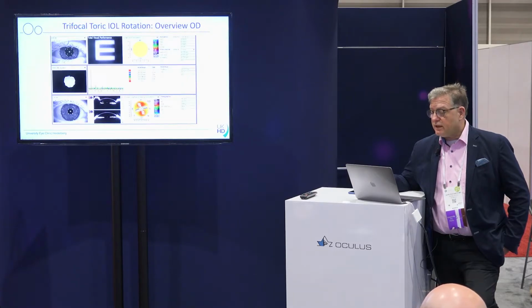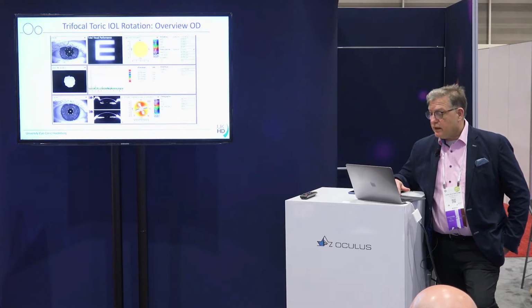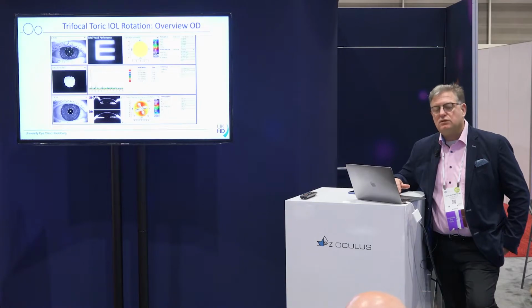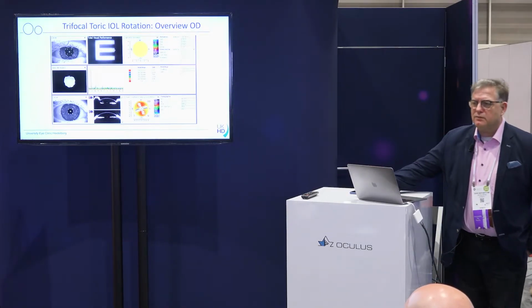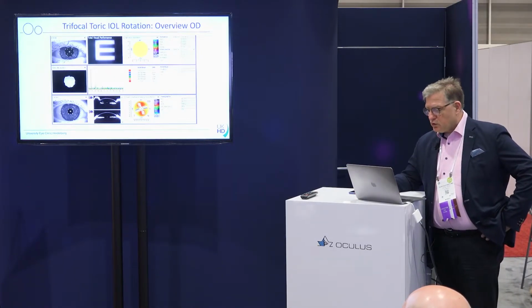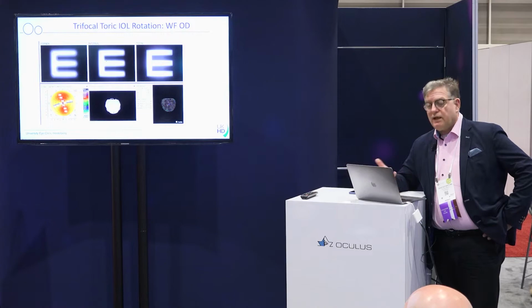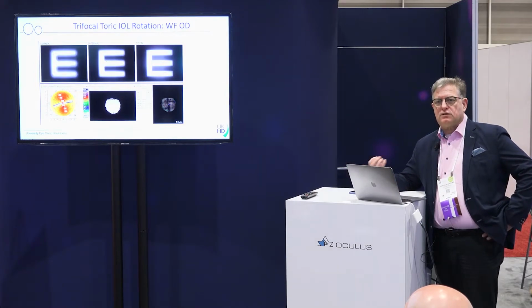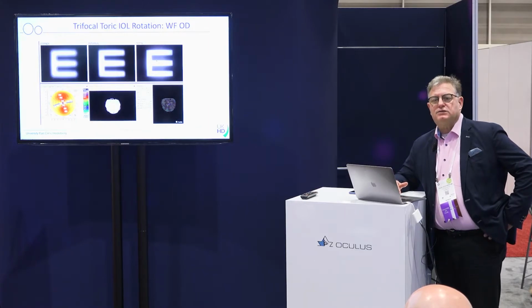So let's look here at the other features of the patient. Go back. And again, nothing really special. And even the total performance doesn't look so bad. It doesn't look like 20/15 vision, yeah, but it reflects a little bit this 20/30, 20/25 output. So when we look at the lens, we see here the cornea, of course, is kind of fuzzy. The lens should be fuzzy also a little bit because it also has a toric component. And then the resulting image is okay, but it's not perfect.